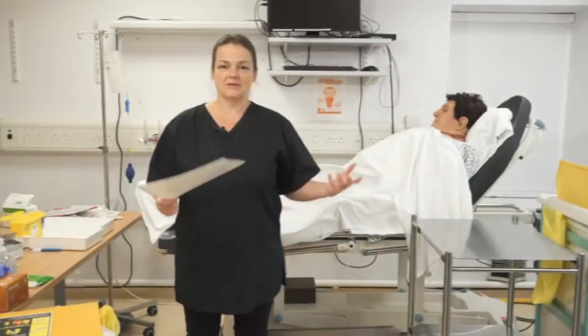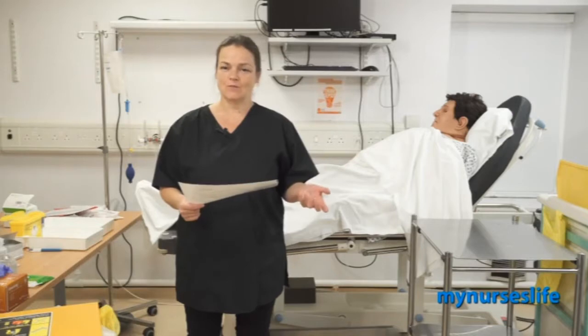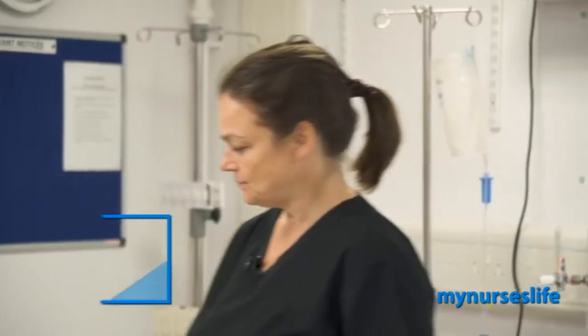So this procedure is subcut injection. It's always glargine, which is a long-acting insulin. It's given once a day. So we're going into the community to give a patient their once-a-day injection, and I'll just go through the procedure now. Okay. So I would declare the area safe.